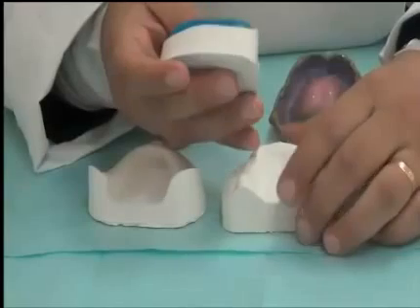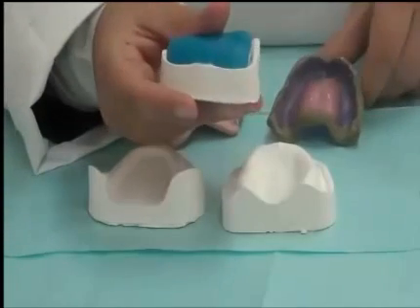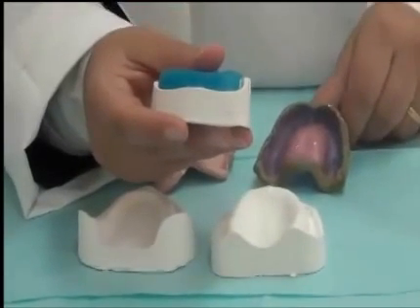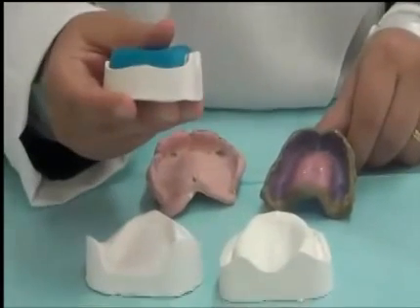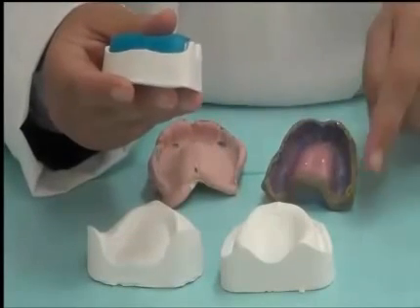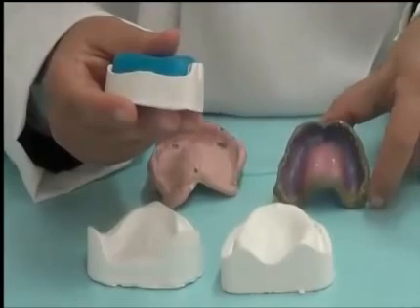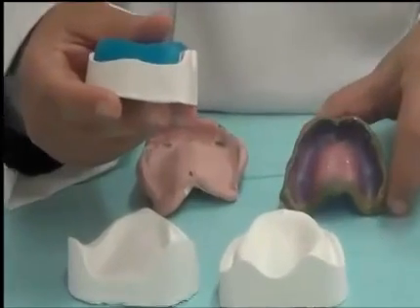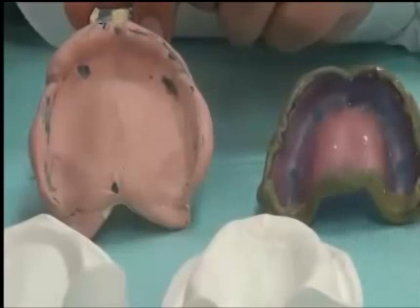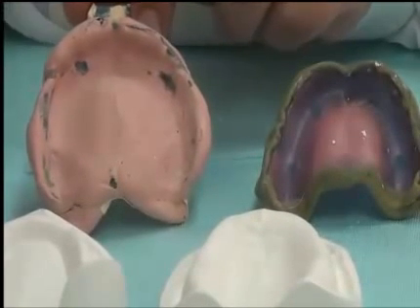Just a final point about the borders of trays. We are going to use this special tray to do accurate and precise impressions of tissue that aid in the retention of the denture. And these are the sulci and the borders of the denture area. As well, we will be recording the full anatomical surface, which we call the basal seat area, which is the area that is opposite to the denture.